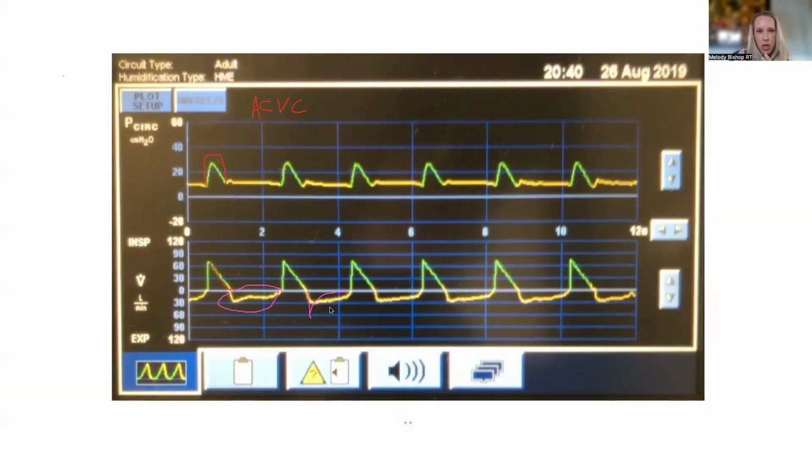Extra muscles during expiration. What do you think? Do you agree with that? I definitely agree with that. Much like you, I try to think about what the normal is, and sometimes I'll even take a picture and draw it on my phone, and then try to see what I'm thinking. So what I have drawn in red, and I'm going to draw in green, which is probably not a great color to use, but I think we'll be able to figure it out.